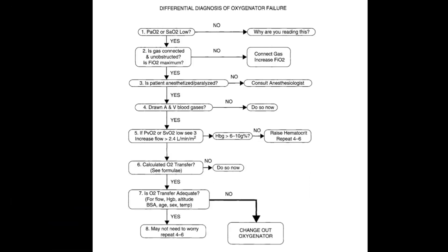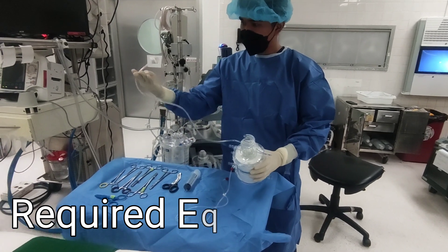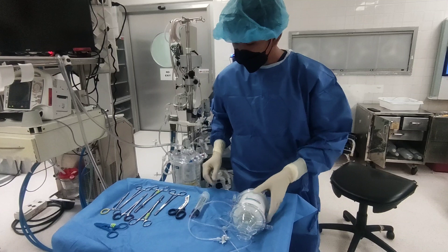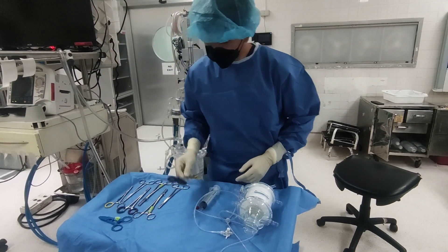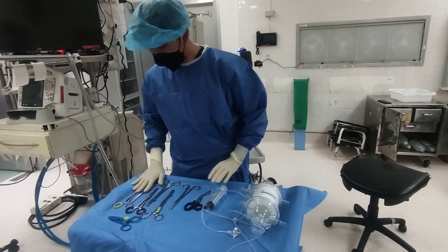Here is the algorithm for differential diagnosis of oxygenator failure. For the equipment required: first, you should have an additional oxygenator with purge line and manifold arterial line attached. Second, an empty 50cc syringe for de-airing. Third, a sterile scissor for cutting of tubings. Lastly, four tube clamps for single clamping, or seven tube clamps if you want a double clamping technique.